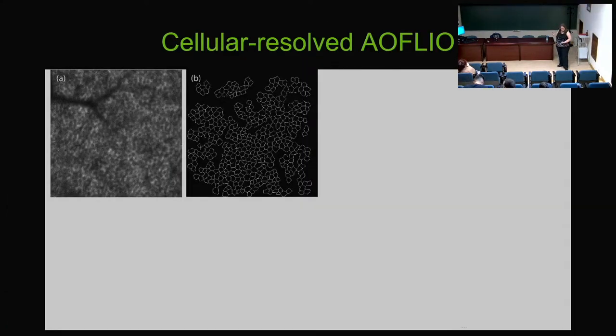And then finally, as I wrap up, I just want to show you one new thing that we started doing. This is brand new. Janet literally finished this figure and sent it out in her thesis Saturday. So I stole it from there because I liked it and I wanted to share it. So Janet has now started taking the RPE images and outlining individual RPE cells.